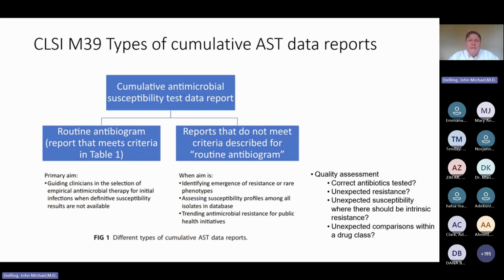On the other hand, I have seen antibiograms where Klebsiella pneumoniae has been 80% resistant or 60% resistant. I saw one example where the Klebsiella pneumoniae were something like 30% resistant. That's not possible. In fact, that particular study did have some genome data done, and with the genomes, many of these Klebsiella pneumoniae, in fact, were E. coli. So there was nothing wrong with the antibiotic result, but the identification was very incorrect.